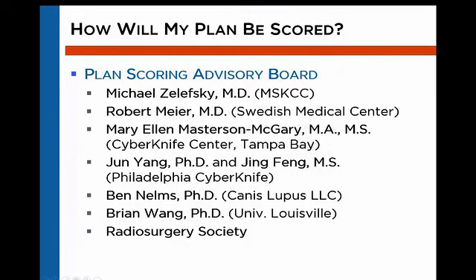How will your plan be scored? Well, this is really neat, and I had the pleasure to work with a pretty knowledgeable and excited advisory board. I wanted to call out some of the people that helped generate the plan scoring metrics for this particular plan study.